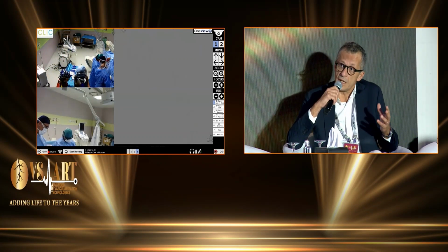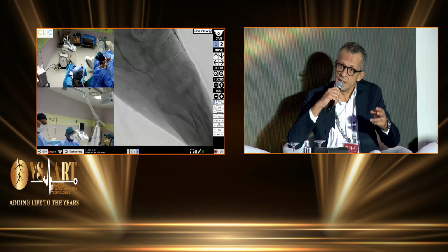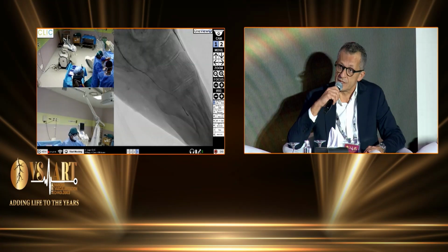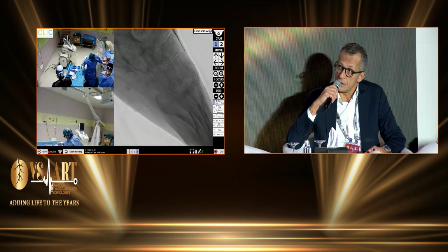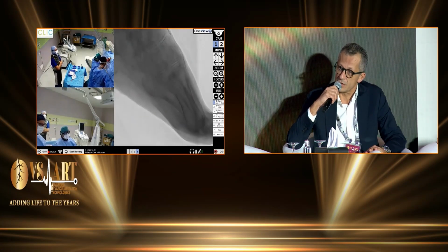So you need to balance well the flow through the new way through the vein and the old way through the artery: a circuit with high resistance and a circuit with low resistance. This is really important to avoid too much necrosis and pain after the creation. But in the next presentation we can discuss all this concept better, I think.